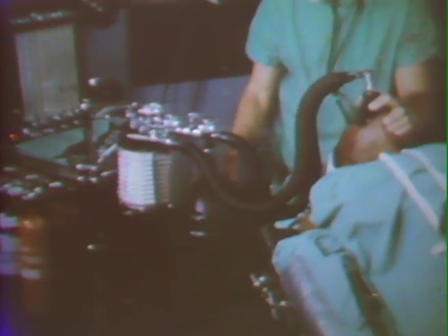Surgery is a complex team operation. The patient, the anesthesiologist, the nurse, members of the medical staff must function efficiently if the patient is to receive the best medical care.